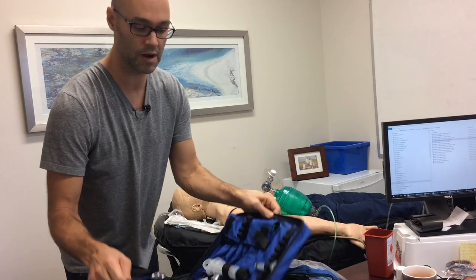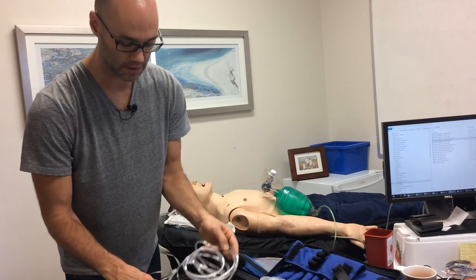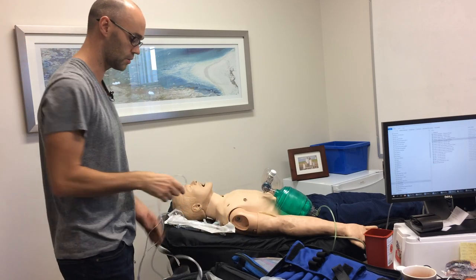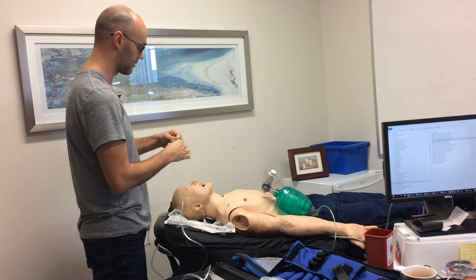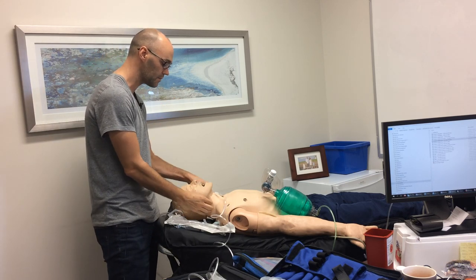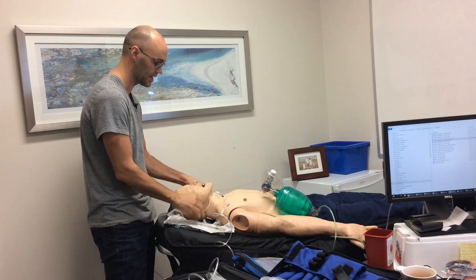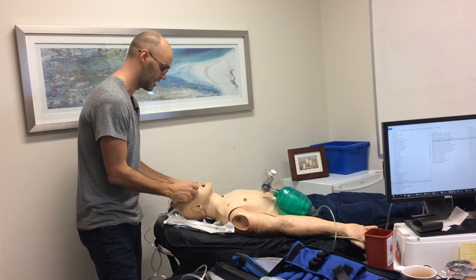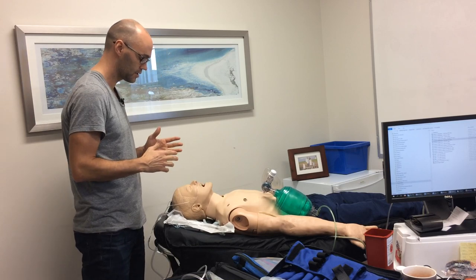Oxygen's connected. We need to grab a nasal cannula so we can do apneic oxygenation while we're intubating our patient. We'll have that in the patient's nose to remind us when we take the bag valve mask off their face. He doesn't have ears so it won't really stay, but we'll say that our nasal cannula is on our patient.